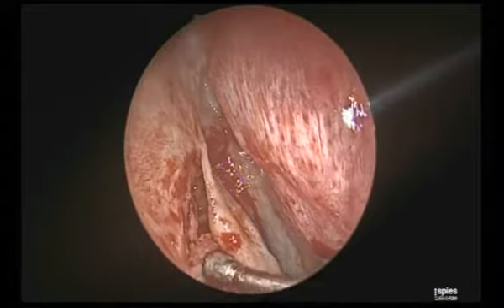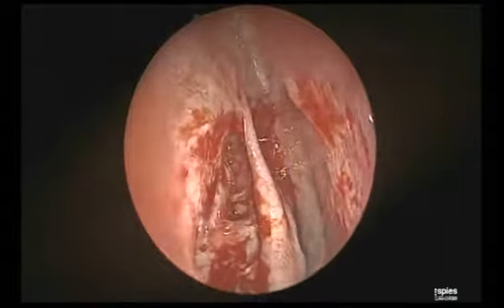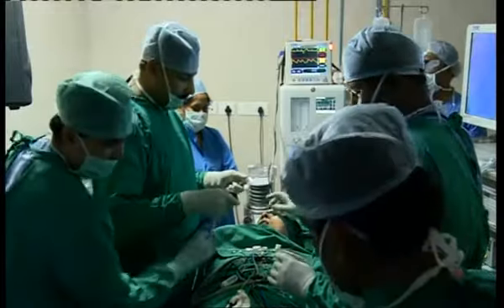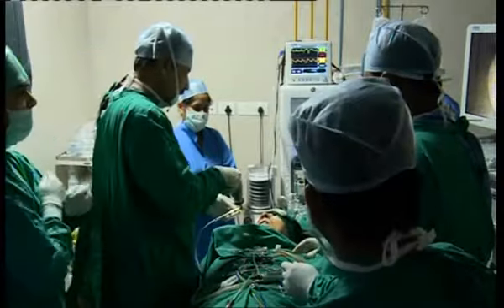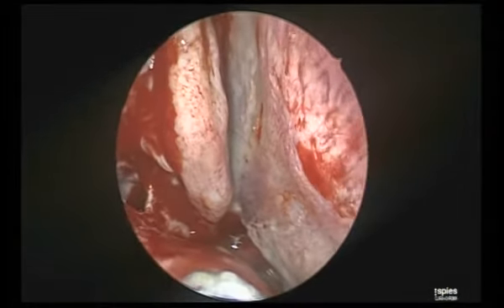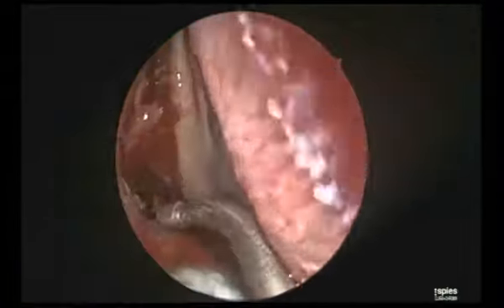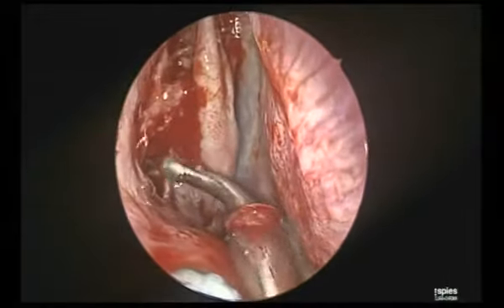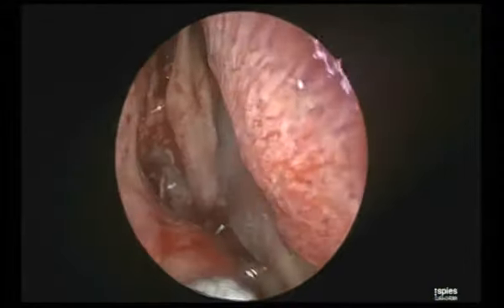This turbinate I told you is going to be very floppy, and we have many ways to handle it. So I'll first tell you, so it doesn't come my way all the time. Though I can operate keeping this turbinate like this, coming all the way is a problem. So I have many ways. Like I told you, I can suture it. I can do Bolgerization. The simplest thing I tell you, I'll just remove only the anterior-inferior part, a wedge resection of this, to prevent it becoming floppy. Okay? The anterior inferior part.